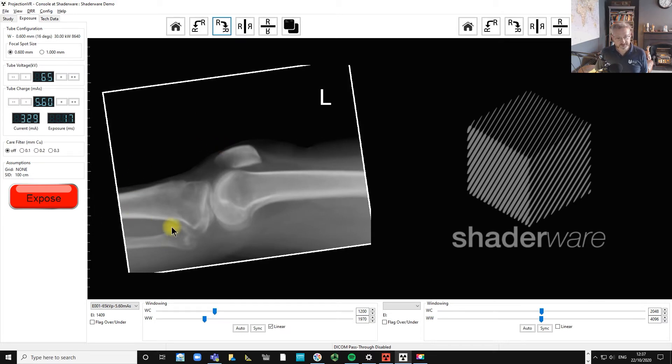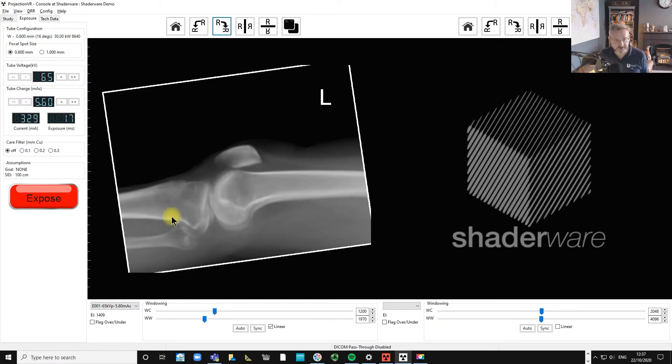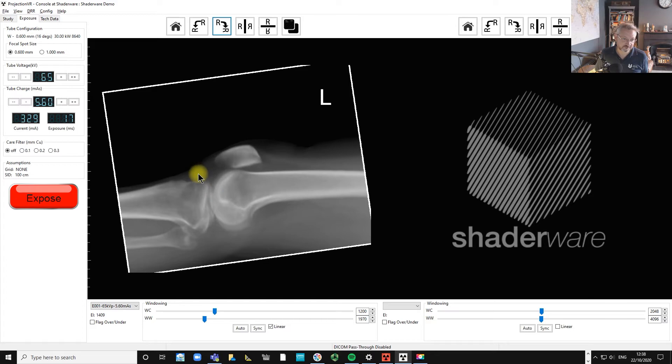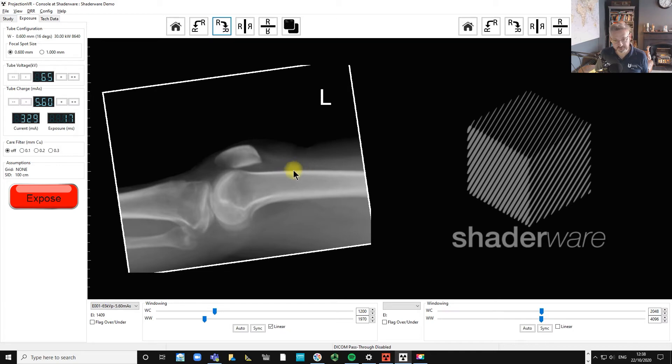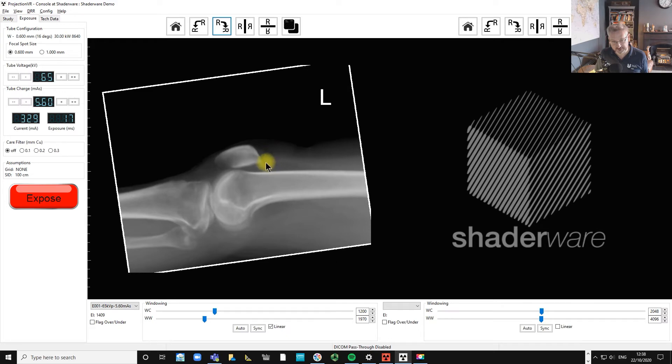I think I've probably over-externally rotated this. We don't actually have a lipo hemoarthrosis here. This is where it would show up. We've got our fat pad here and the fat pad would be pushed up if we had an effusion.